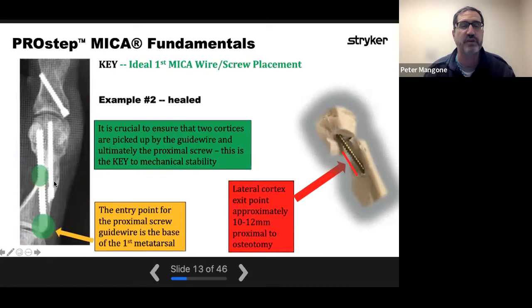Here it is after healing — you can see the proximal and distal entry points with plenty of new bone formation. The second screw functions to add rotational stability to the construct and allows for earlier weight bearing. You have to be careful not to go too far distal with that second screw, because if it's too far distal, it can interfere with removing the medial cortex overhanging bone, resulting in that screw becoming unstable or prominent and needing removal. That's been my most common complication — about 10% of the time I have to take that screw out because it's prominent.